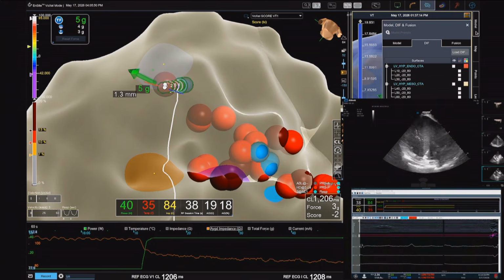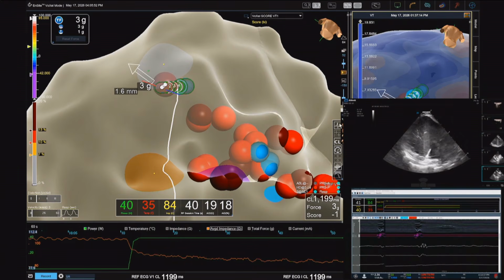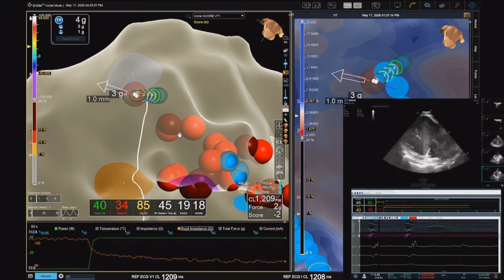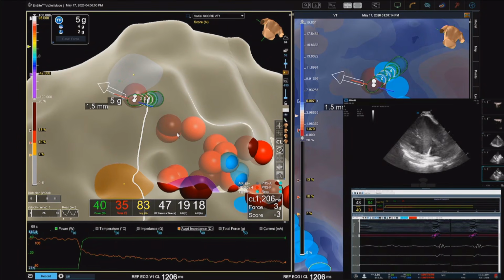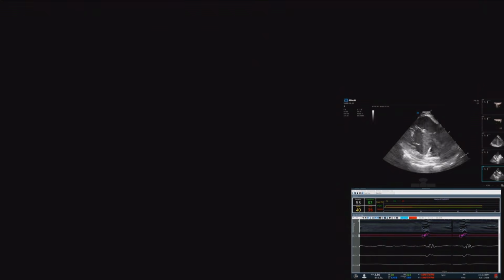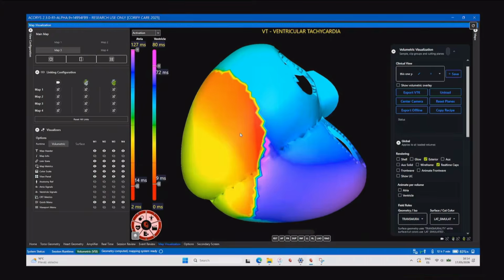Was there any utility of body surface mapping, because the case was declared to be facilitated by ECG imaging? Yeah, if we move back to the body surface mapping, please, Esther, can you show the ECGI again? So you see where we are now. I will stop ablating just in case I move. Can you put the mouse at the exit of this deceleration zone, exactly here? So this region is more or less the septal exit of the channel.